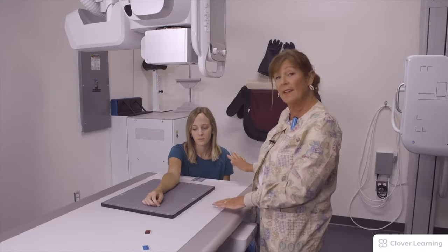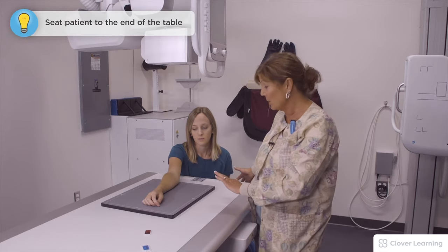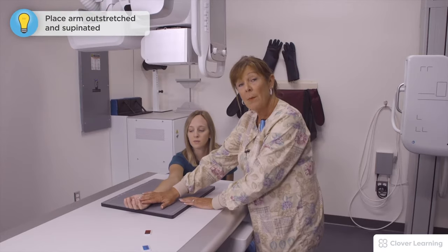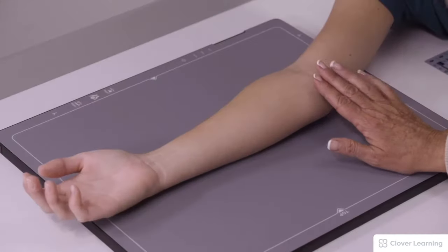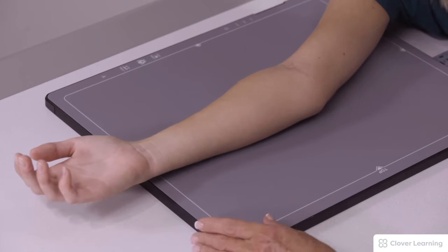So I have the patient sit at the end of the table at a right angle to the table. We have a shield placed on her lap. She's going to outstretch her arm, and her arm's going to be supinated with her palm of her hand up. We're going to center right in the middle of the elbow joint. So I'm going to make it more comfortable for her.